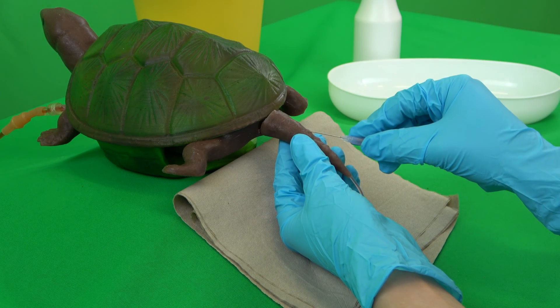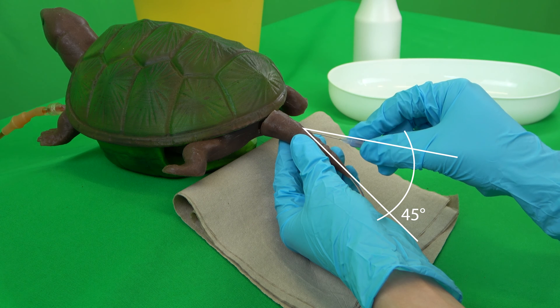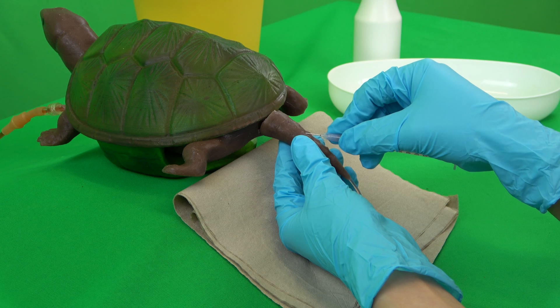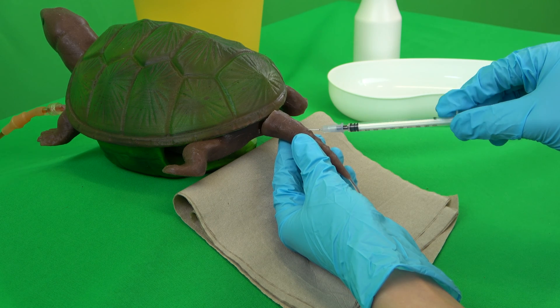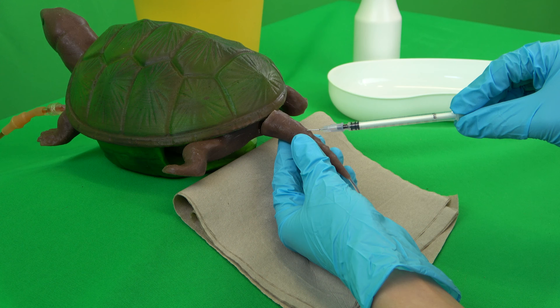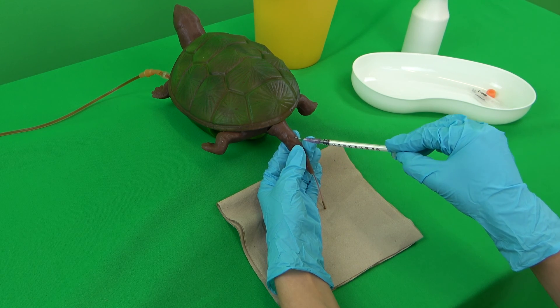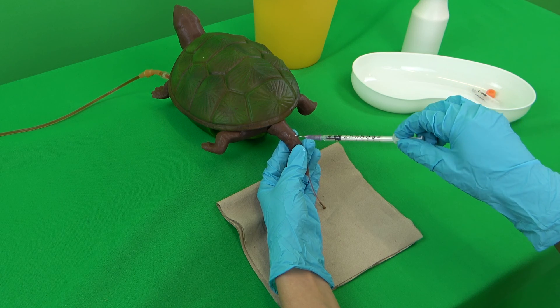Now, the prepared syringe and cannula are taken into the dominant hand. The bevel of the cannula points away from the animal when it is inserted. It is pierced dorsally into the tail between the scales at an angle of 45 degrees until a resistance is felt. This resistance is the spine. Now the cannula is pulled back slightly to aspirate blood from the vein sinus above. If no blood can be seen in the cone when the syringe is pulled back, you should change the position of the cannula without pulling it out completely.